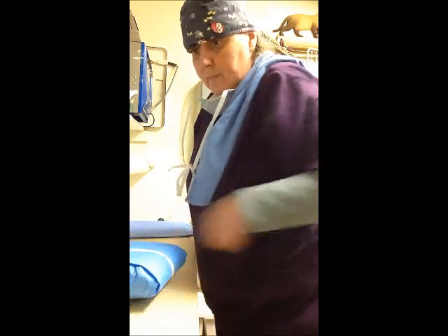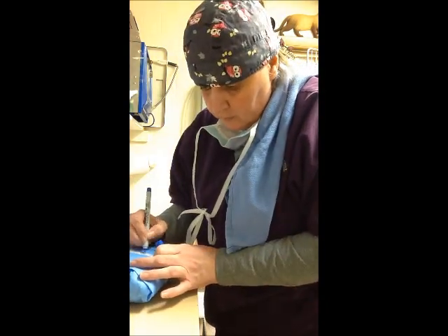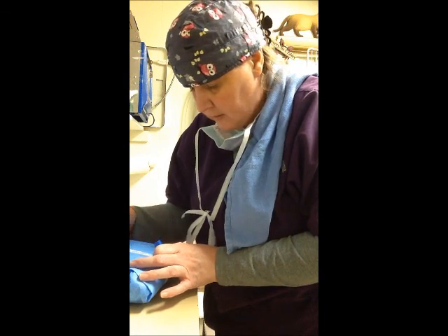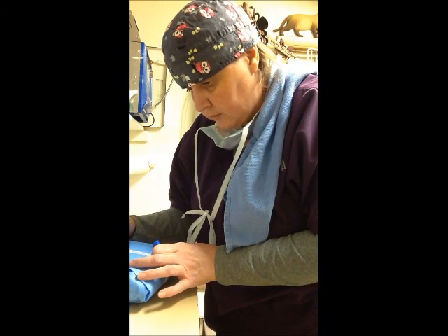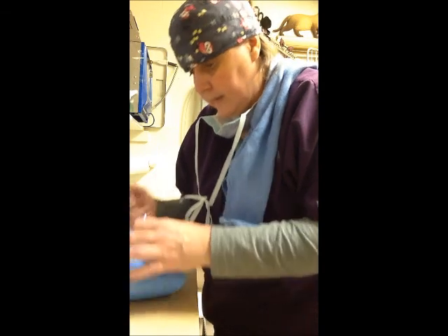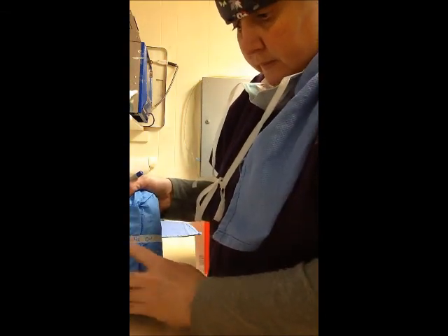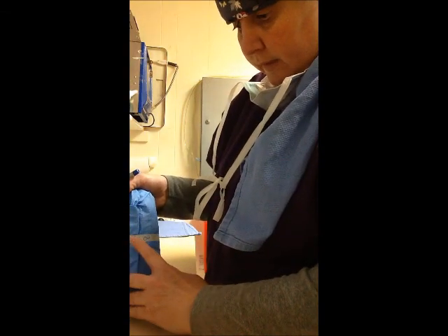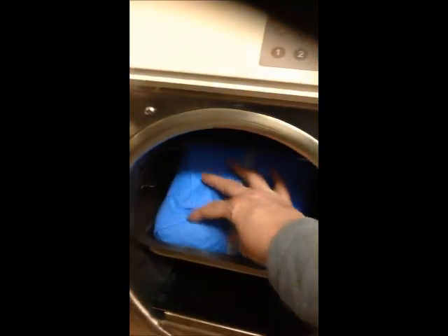So, and then again we label. In this case it's an extra large gown. 122 to 722. 18. And my initials. For an extra large gown. The date that they did it today. 722 and my initials. This is going to go in with the afternoon surgeries.